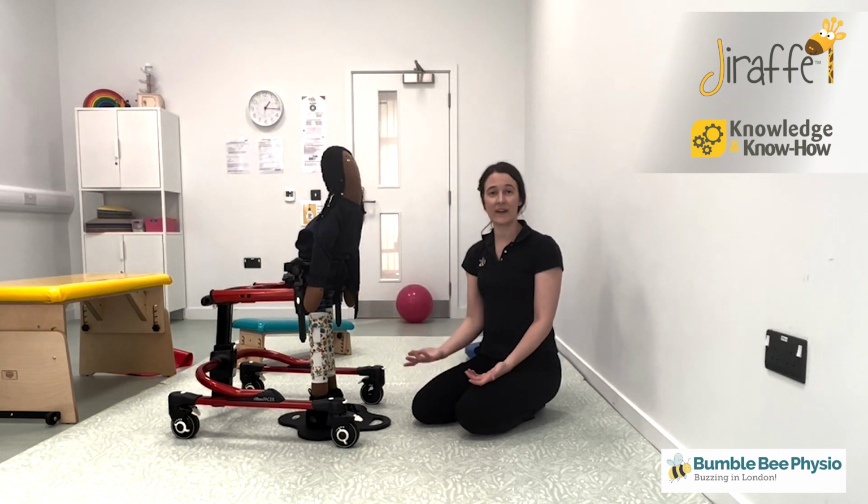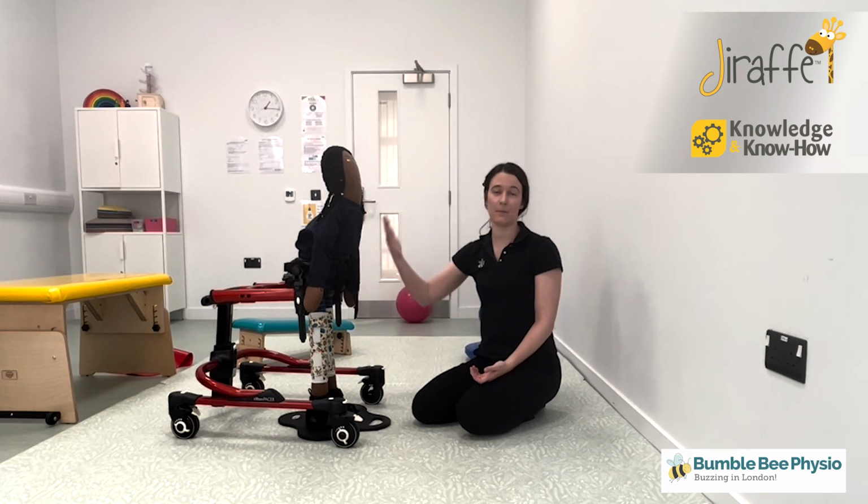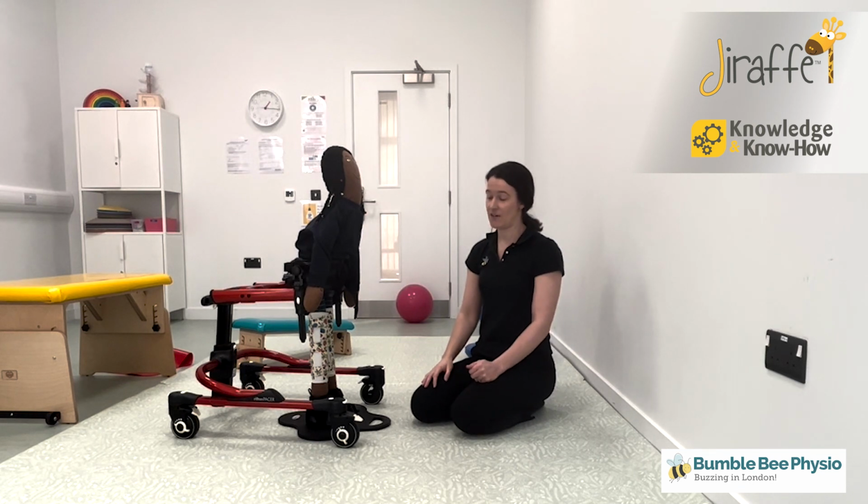If they can talk, they can give you feedback. If not, you might just find some reluctance to do it or some signs of pain in their usual ways if it's too much of a stretch. And if that's the case, then you can just bring them back up and give them a rest. And actually, you might want to just carry on with some static standing with them.